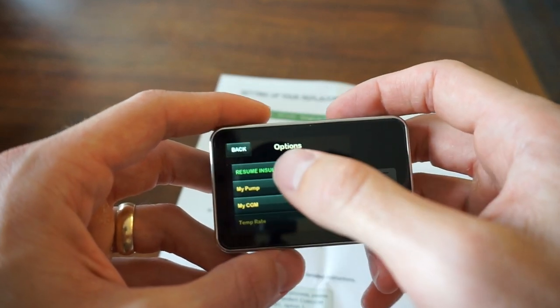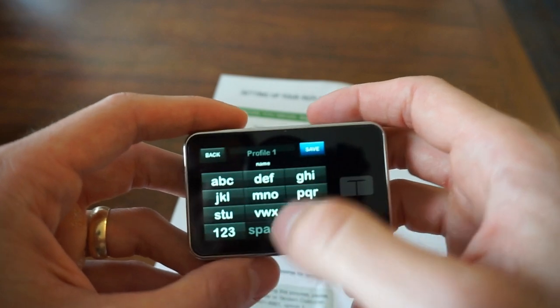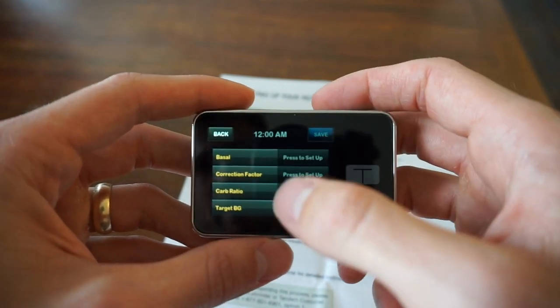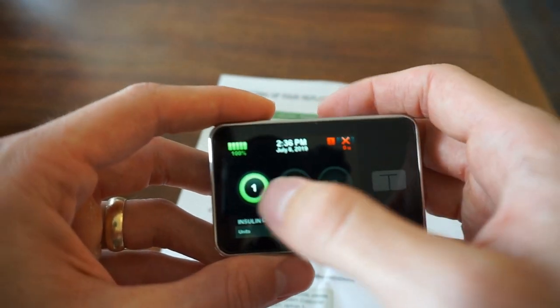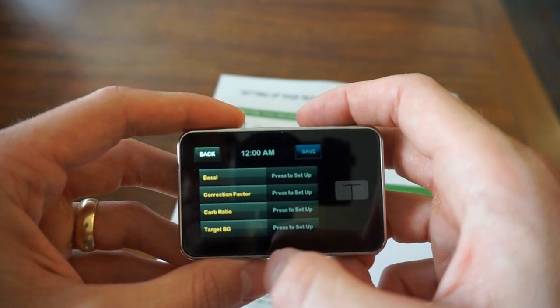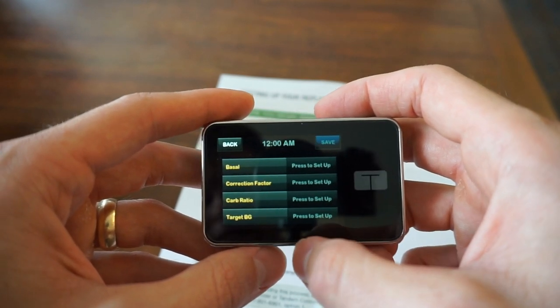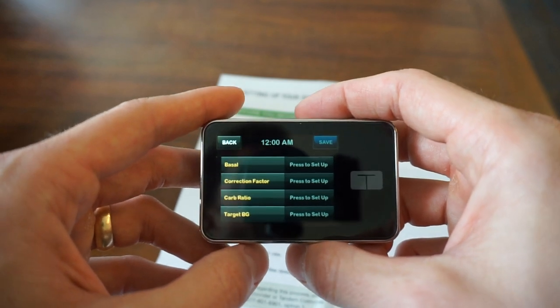I'm going to go into options, then into my pump, personal profiles, hit new. It's already called Profile One, so we'll keep that. Press to set up. We've got Basal at midnight — 12am — Correction Factor, Carb Ratio, and Target Blood Glucose, all showing press to set up. I'm going through those on my own because I don't want you comparing your carb ratios and basal ratios to mine, so I'm not going to put those in on video — but that's how you set up your basal and bolus settings.